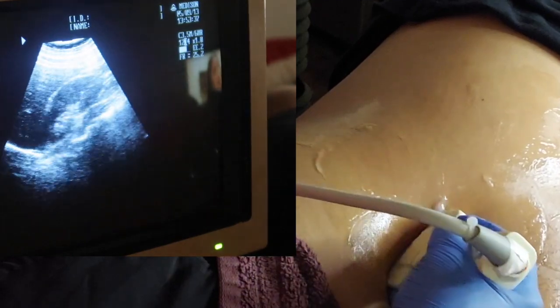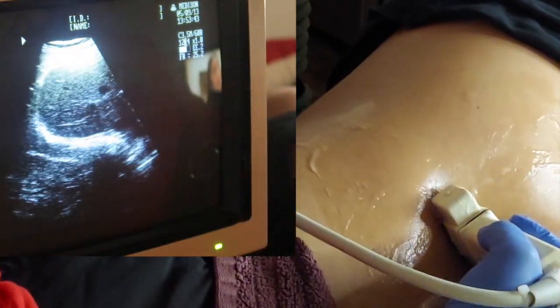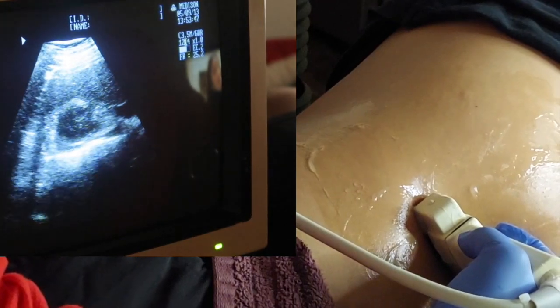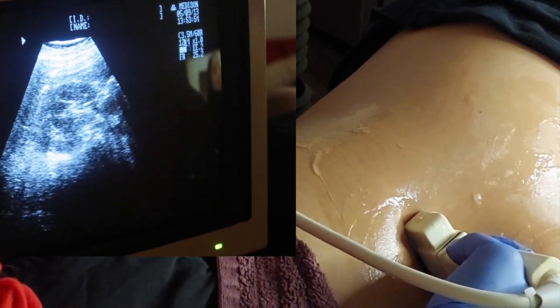You just tweak your probe just a little bit to move the image. The next thing is to go transverse. Let me go into my liver so I can get my superior right kidney, then just move down a little bit. You can see the hilum coming in — that's your transverse kidney.